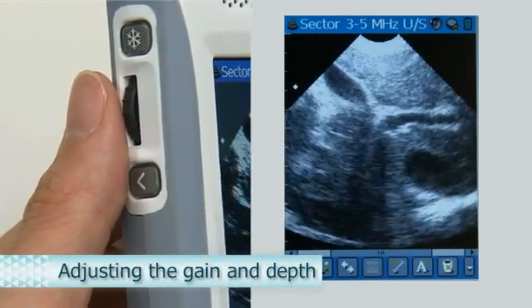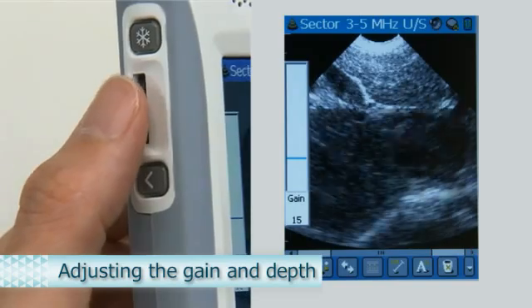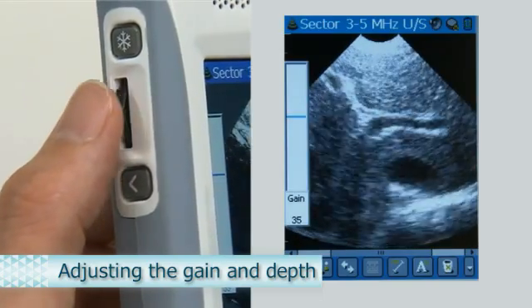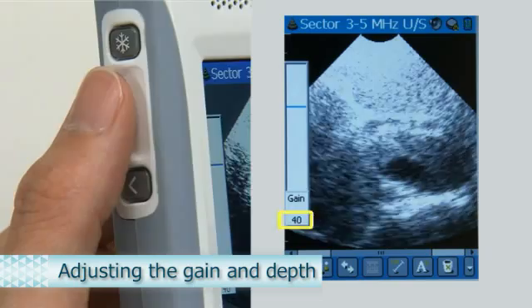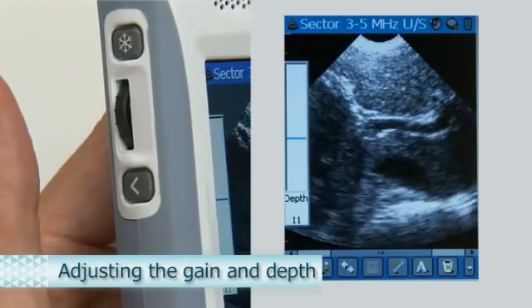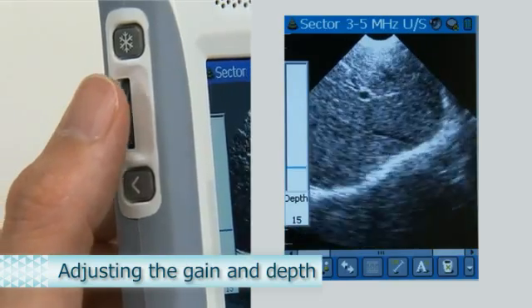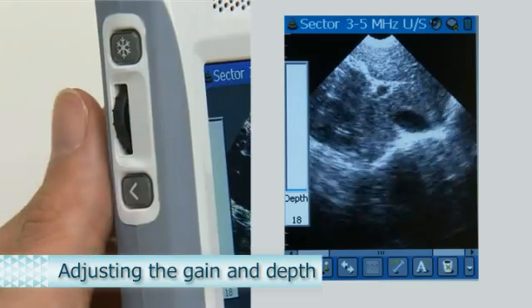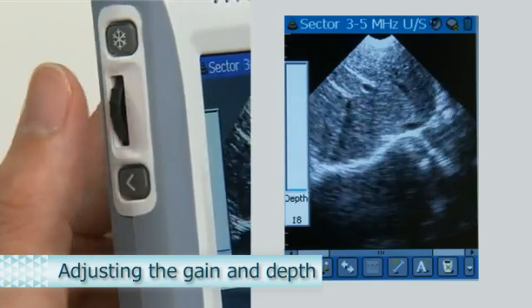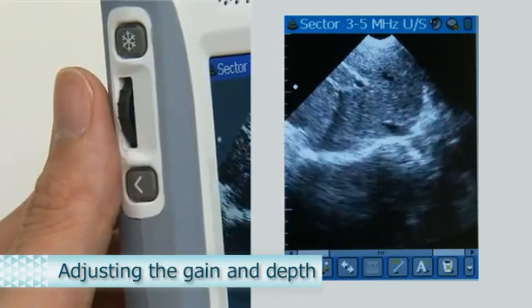To adjust the gain while scanning, scroll the scroll wheel up and down. An adjustment bar appears on the screen displaying the gain value; the bar moves as you scroll, changing the gain. If you click the scroll wheel once more during scanning, the display changes to Depth. A bar for adjusting Depth and the Depth value are displayed. The display switches between gain and depth adjustment each time you click the scroll wheel. These adjustments also apply in M Mode and PW Doppler mode.